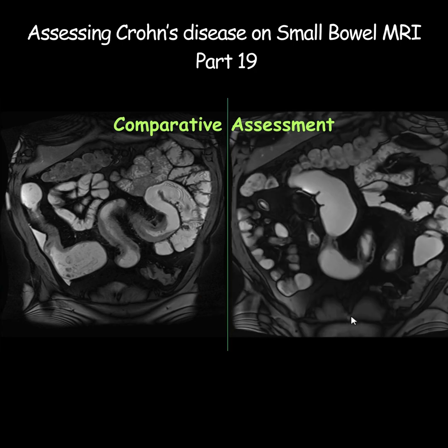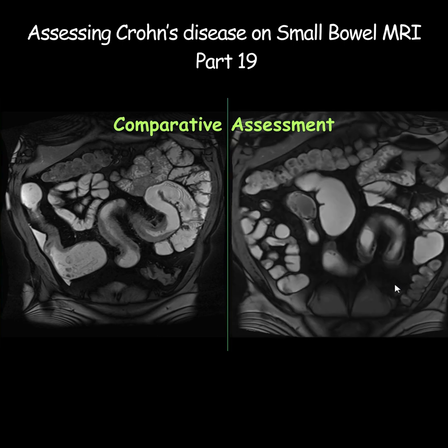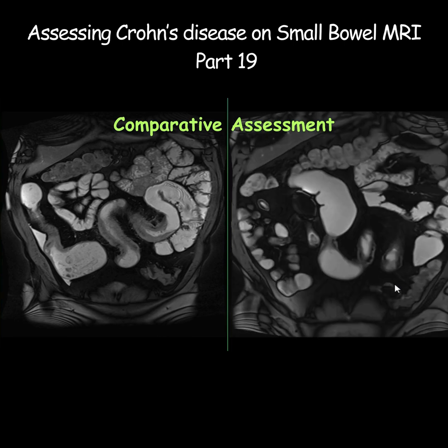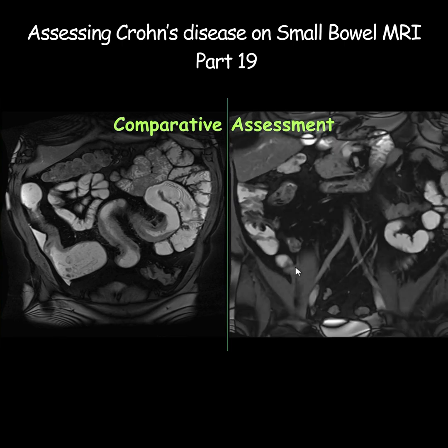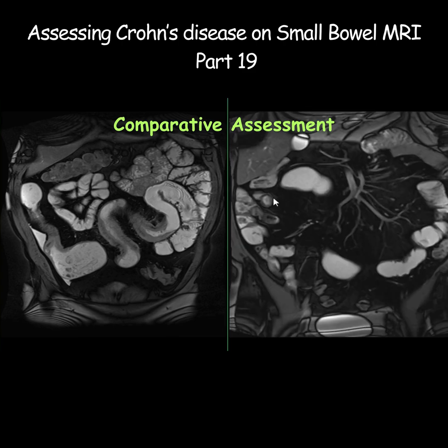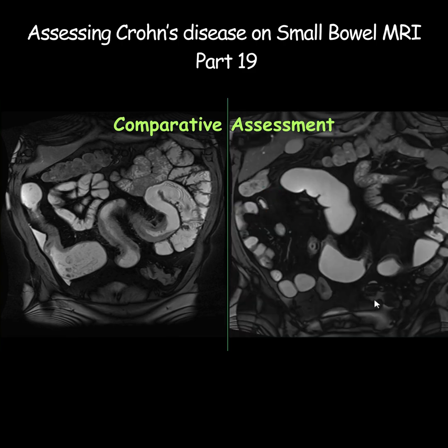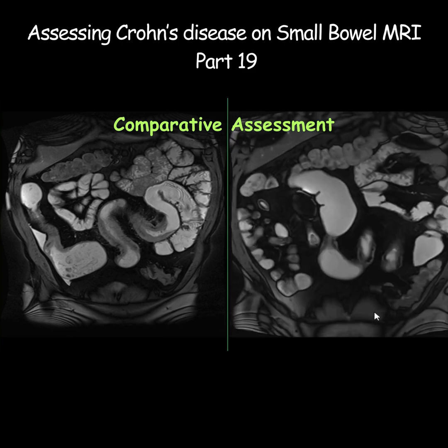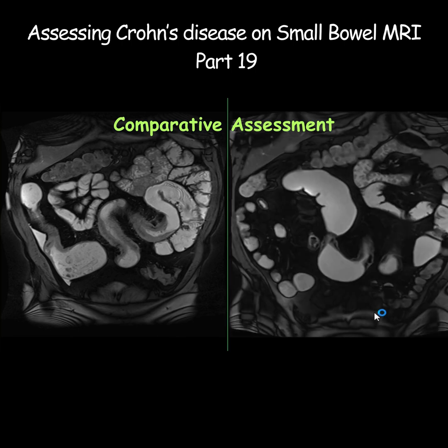On the previous scan there were obviously several segments of abnormal bowel wall thickening, luminal narrowing, and pre-stenotic dilatation with some skip areas in between, but the disease was mostly fibrous stenotic with no significant signs of inflammation.